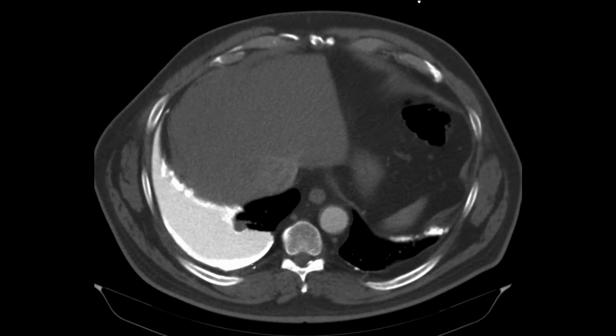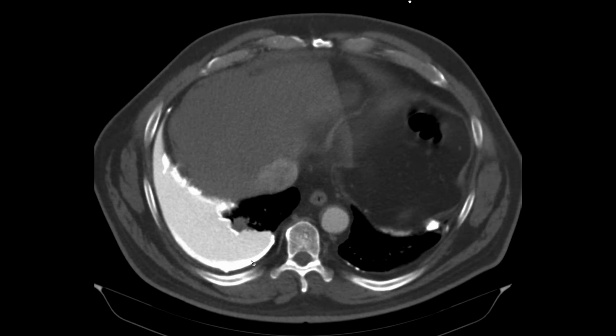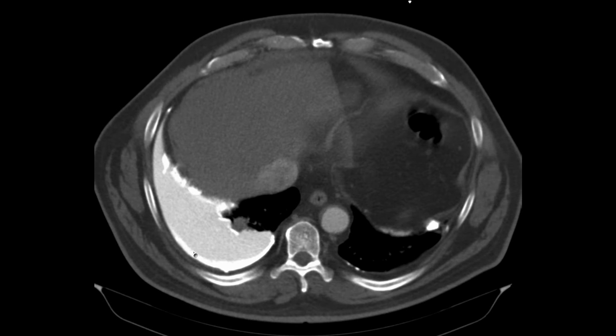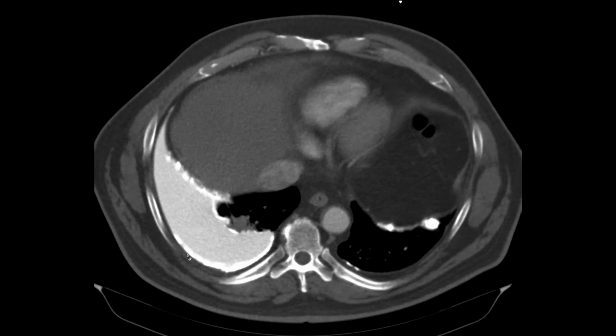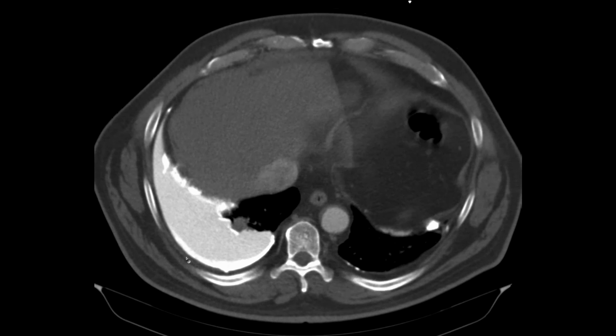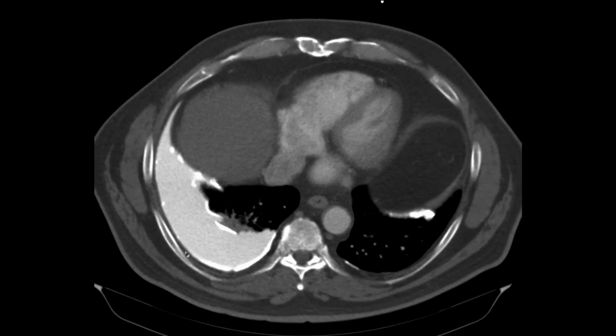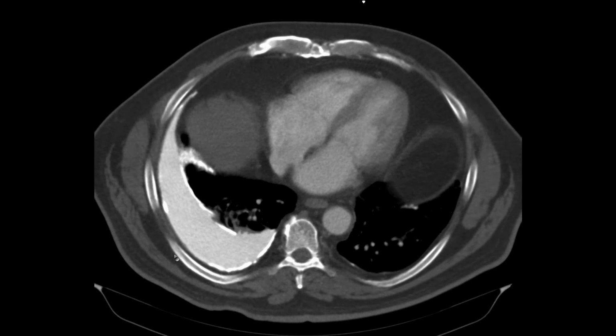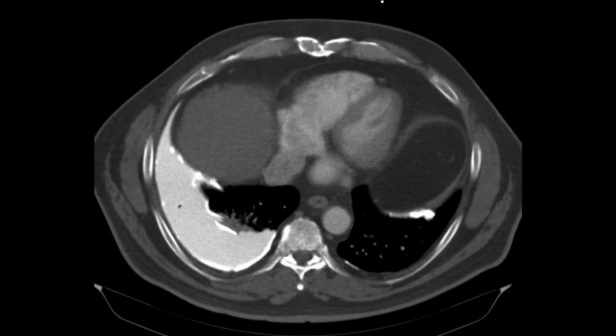So that was a surprise. I encouraged the surgeon not to do anything about that. I think they actually tried to tap the fluid and only got a little bit out, and perhaps it's hard to get a needle through that. And maybe this is really thick stuff, not easy to come out of a small needle. So perhaps not surprising they didn't get much out of that pleural fluid. But I'm not even sure they should have done that because, as best I could tell from the notes, he probably wasn't symptomatic from this, even though it's pretty impressive.